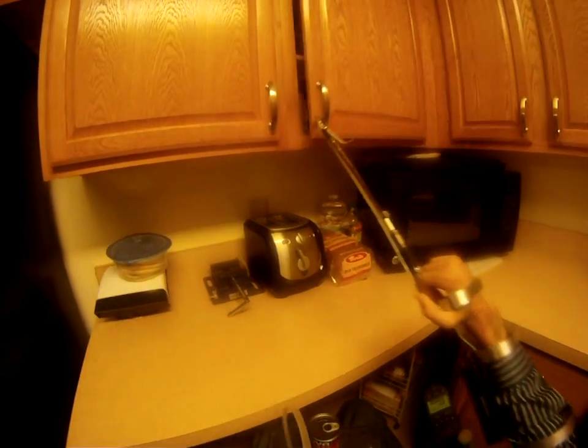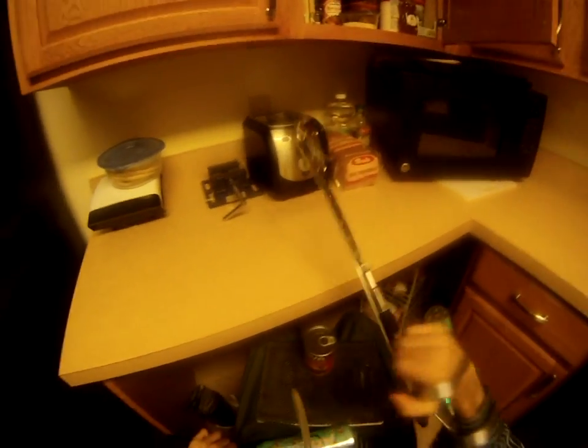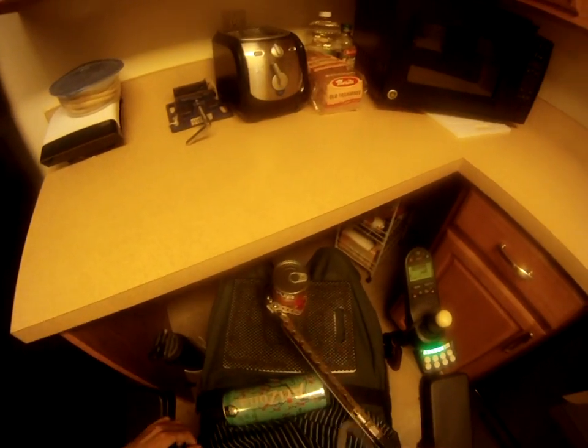Even full cans of ravioli, soup, or gravy are no problem. The jaws are plenty wide enough and strong enough to lift them without slipping.